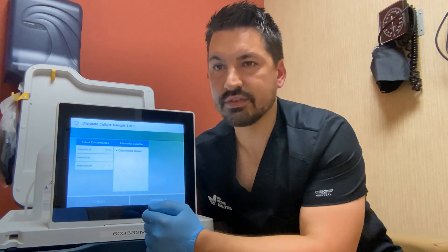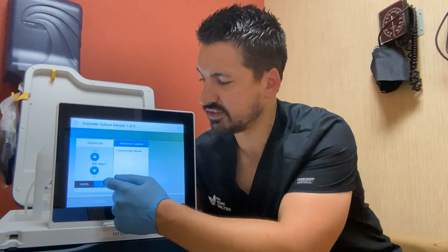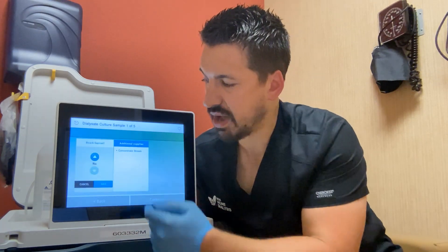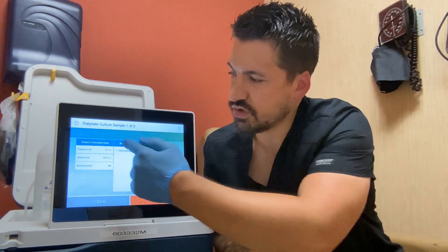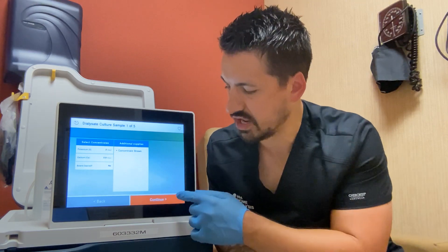The next option is calcium. Select the calcium button — it defaults to 2.5, which is pretty standard for most baths. Next, it asks if the bicarb is expired, and it defaults to no. Don't be fooled into selecting yes thinking you're confirming you checked — the answer is no, it's not expired. Once that's filled out, the orange "Continue" button at the bottom will illuminate and you can select it.